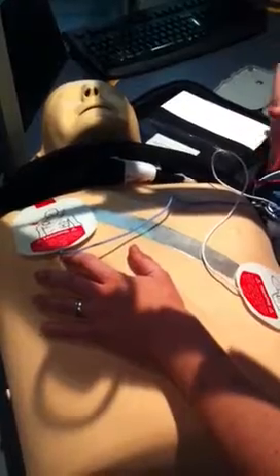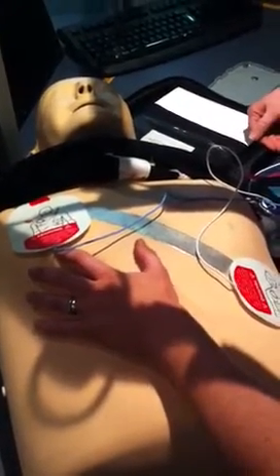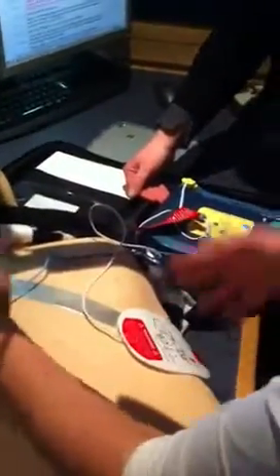You just keep listening to him. Analysis will resume. Okay, right. Interesting. And the other thing as well is, we have to stand clear when the patient has been shocked. We see on TV they kind of jump upright, and does that happen? They will move. Okay. Not as dramatic as you often see on TV.